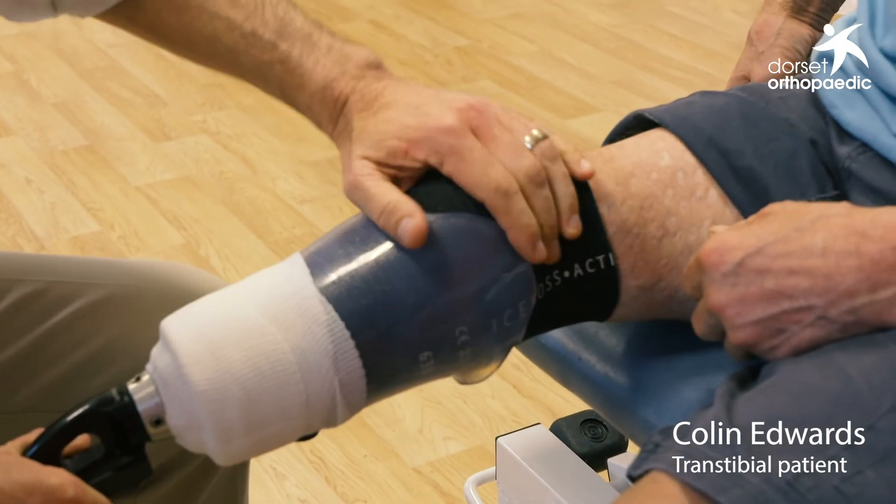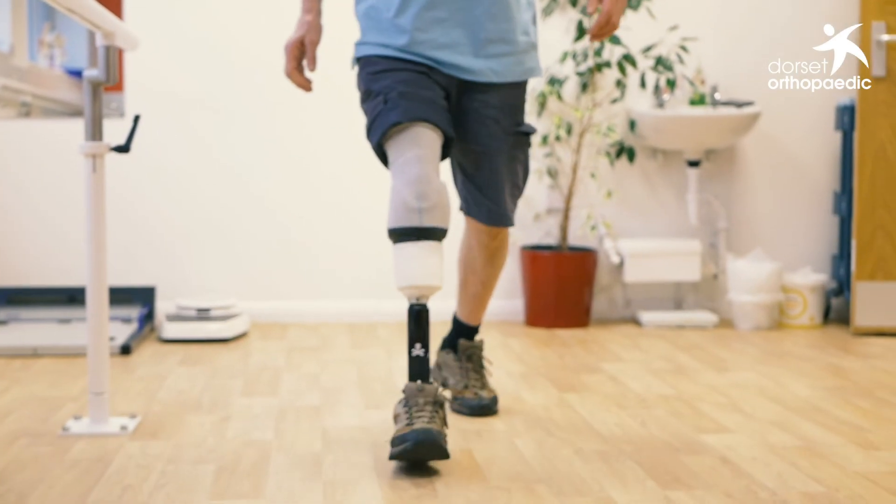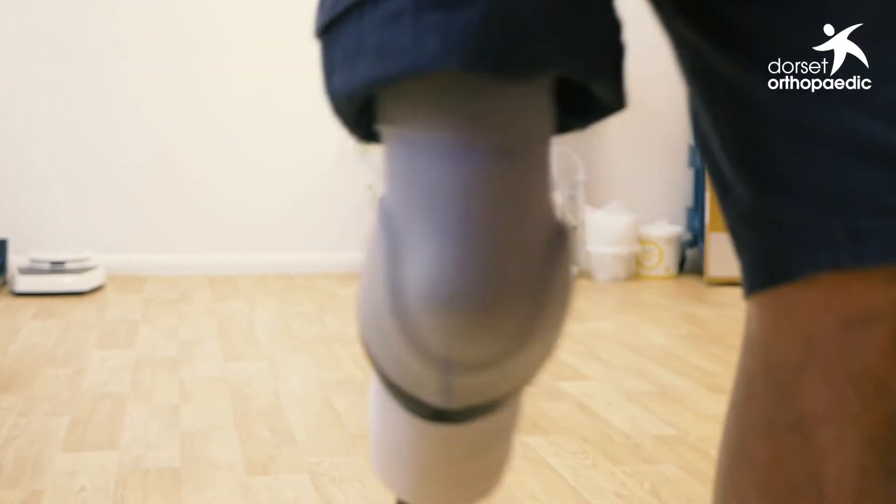It was instantly comfortable, and the beauty of this is the quick turnaround — I came in this morning and effectively I'm going to go out at the end of the day wearing a limb. Dorset Orthopaedic have always tried to be at the forefront of socket technologies and giving patients comfort in their everyday prosthesis.